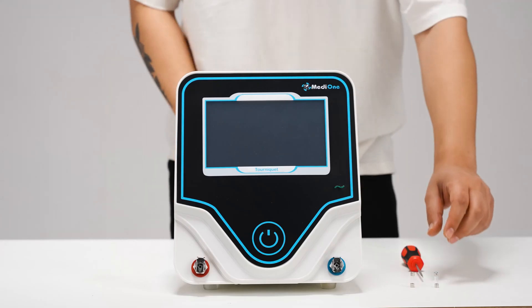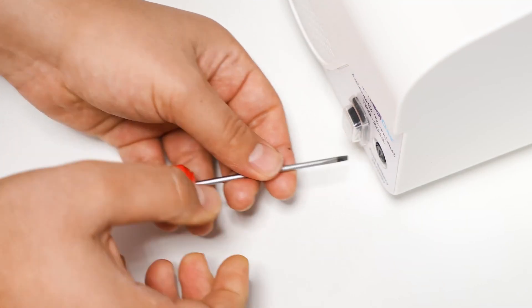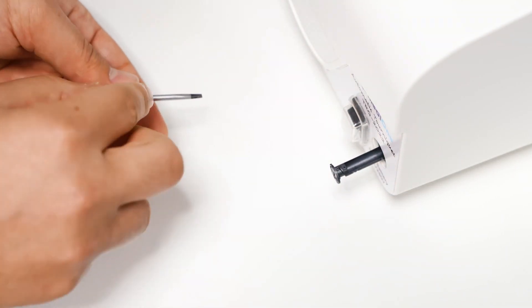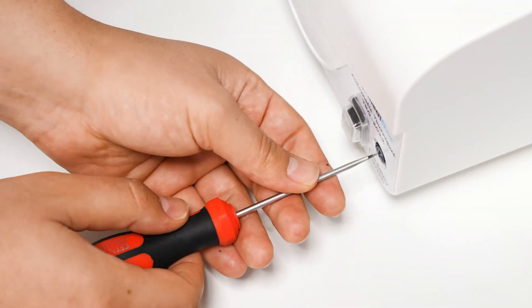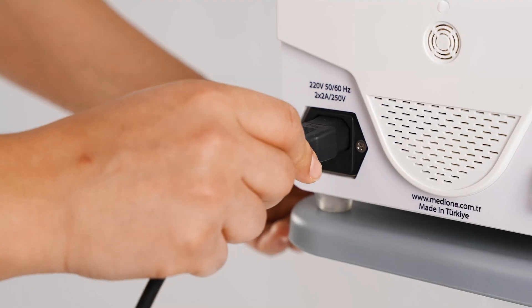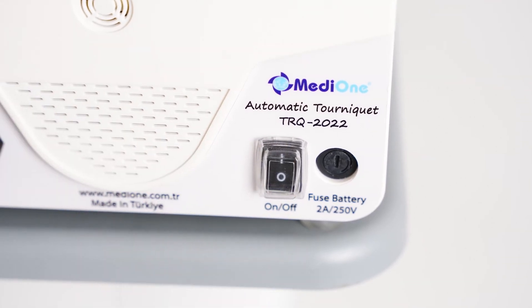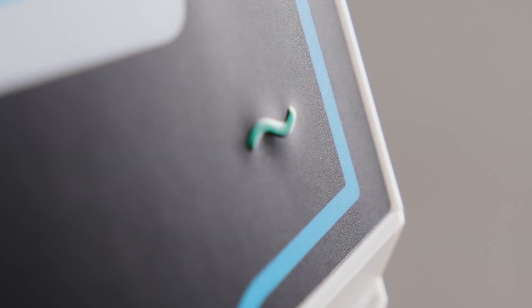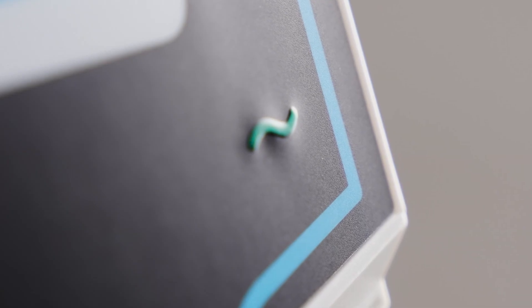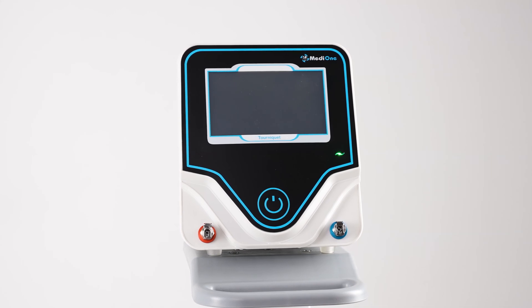Now we can move on to the preliminary stage. First of all, we insert the battery fuse into its slot. Then connect the power cable to the device and the power supply, and turn the ON-OFF switch on the back of the device to the ON position. If we see that the AC power indicator in the lower right is green, it means that the connection has been successful.